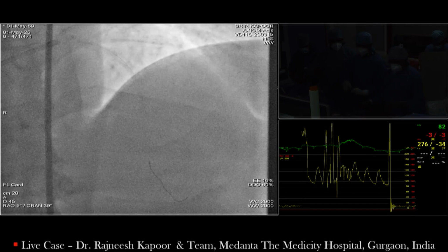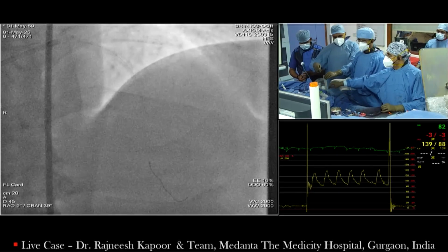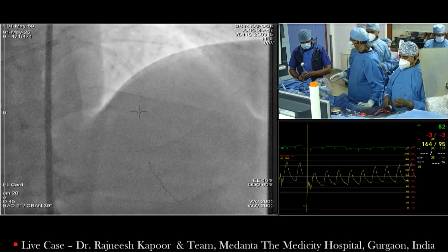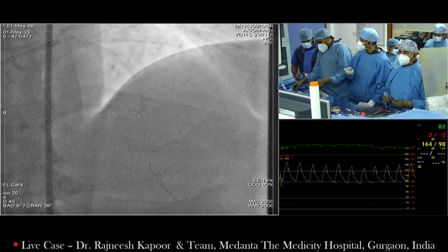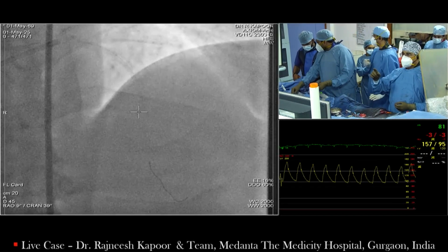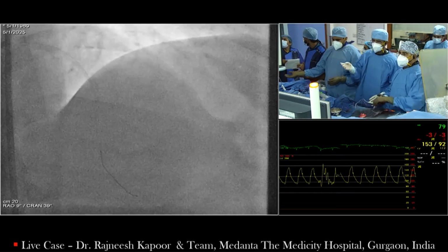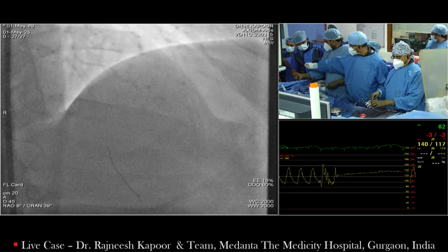So after taking out the orbital wire, are we audible? Hello? Yeah, you are audible, Rajneesh. Okay, great. We have taken the wiper wire out and exchanged it with the All-Star wire, and then you saw the movement of the balloon. It was much smoother. We have dilated the whole segment with a 2.0 balloon, and I'm giving you a shot after that.